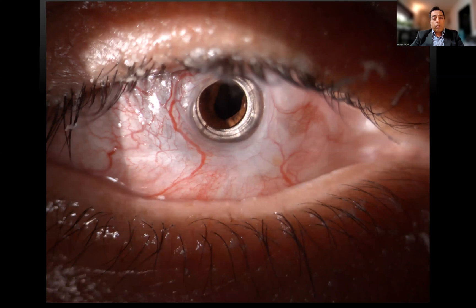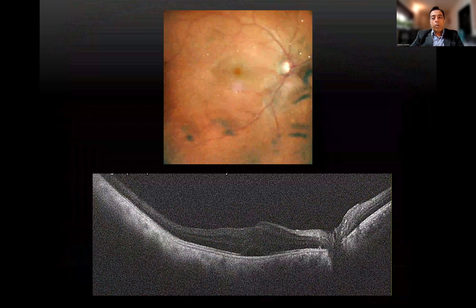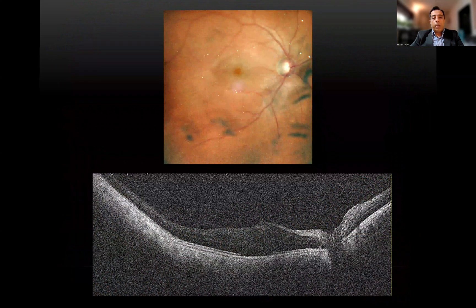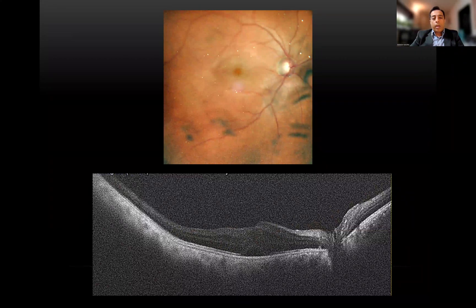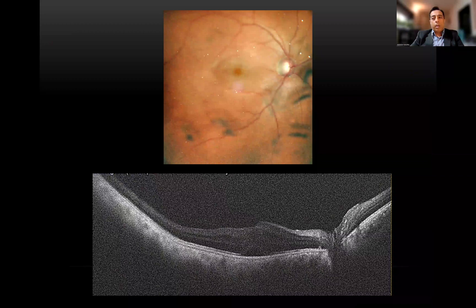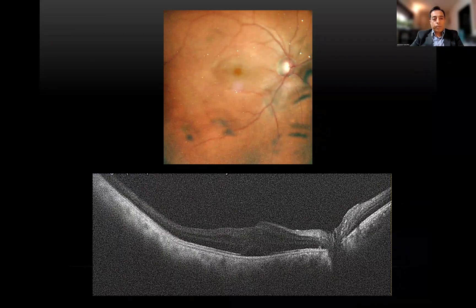In patients of keratoprosthesis, where clinically looking at the fundus is extremely difficult, the patient had come to us with decreased vision. We could not see clinically, but the Mirante could get us a nice image and also an elevation which suggested cystoid edema. We gave the patient Kenocot and it improved.